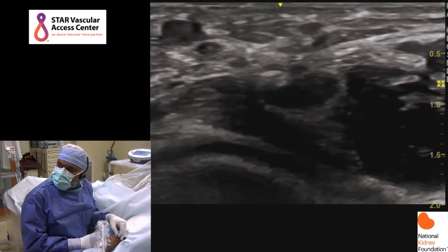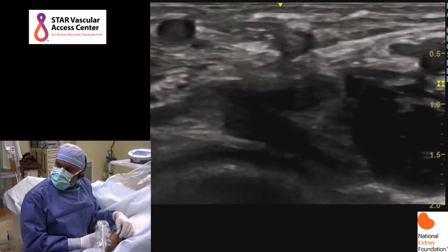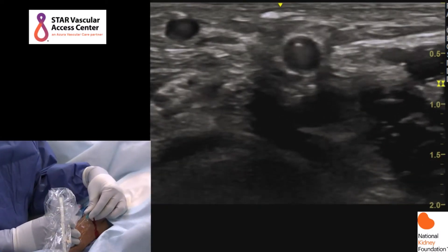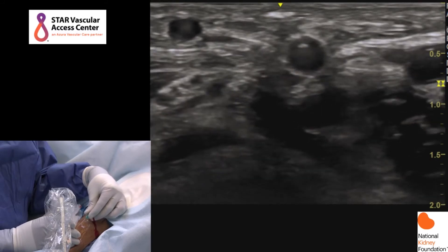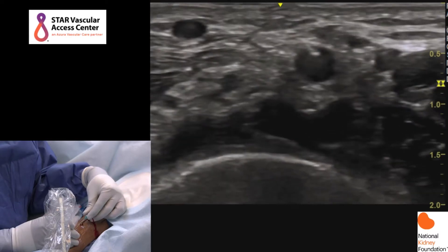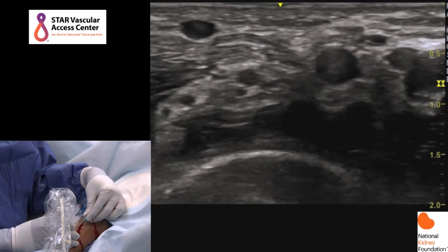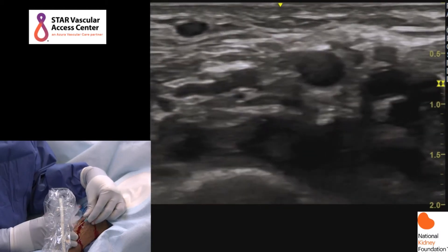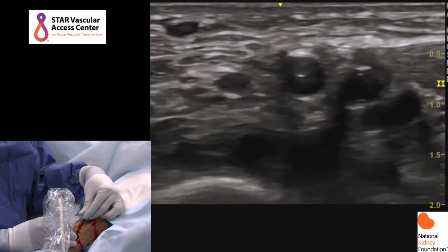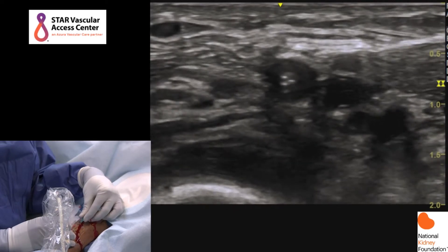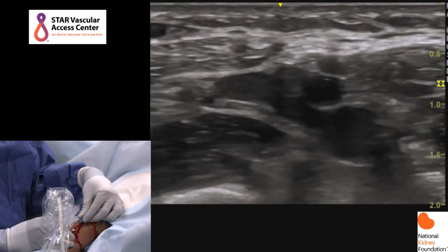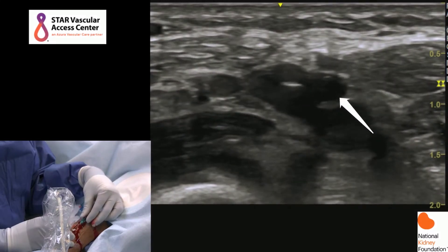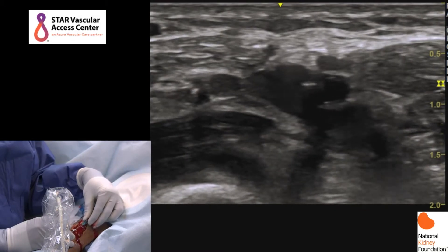I'm poking into the vein. I have a flashback and here you will see the tip of the needle. I'm going to go down the vein, scanning down just a millimeter at a time, advancing the needle as well so that the tip of my needle is always visible. You will notice that the radial artery is also coming into view. As I scan down and advance the needle, I am right next to the radial artery — if I move the needle to the right, I can actually poke into the radial artery.